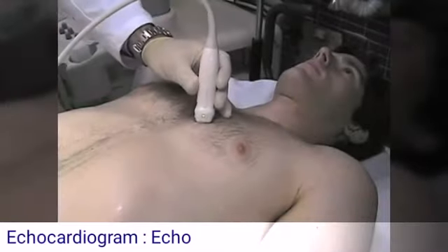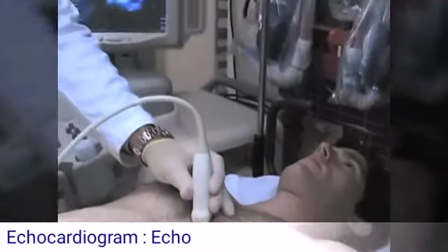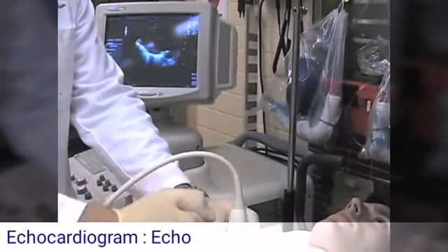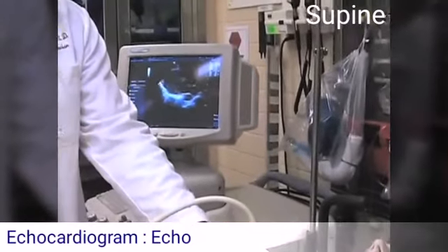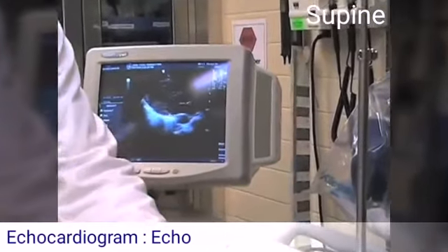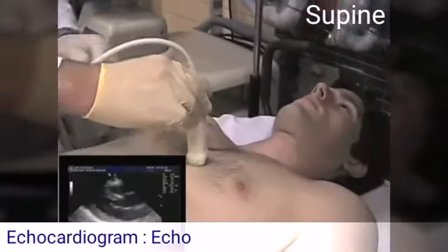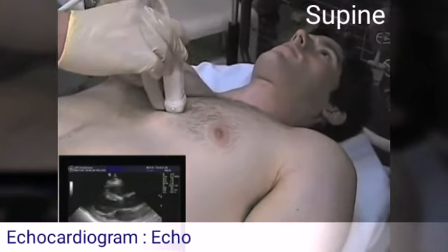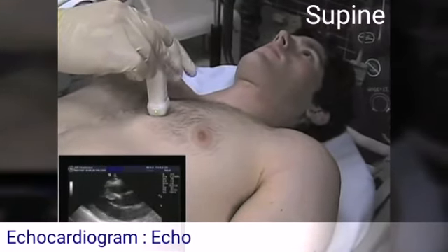Plane, and we may have to compensate by moving the probe up one or down one position to gain the best views of the heart. Here's the parasternal long axis view in action. Note the great view of the heart on the screen. The parasternal long axis view of the heart probably gives the most overall useful information about general cardiac dynamics and can be very instrumental in general emergency care.